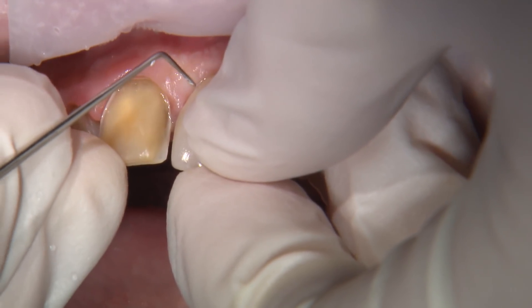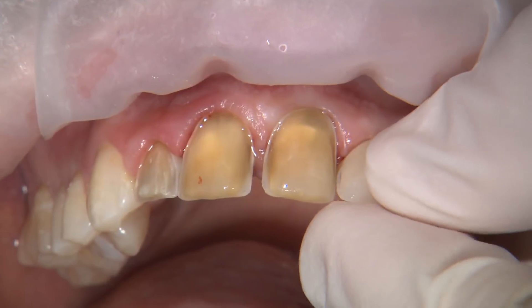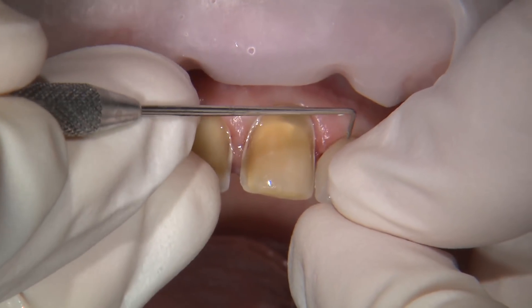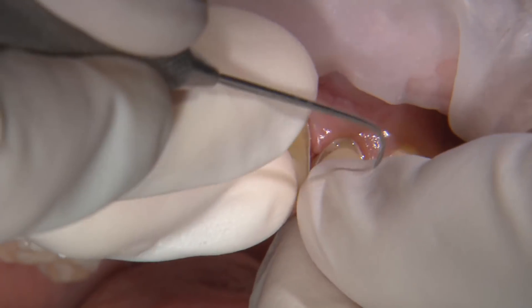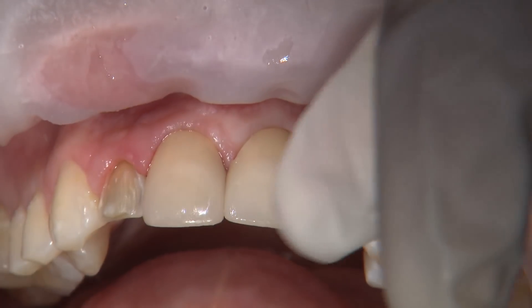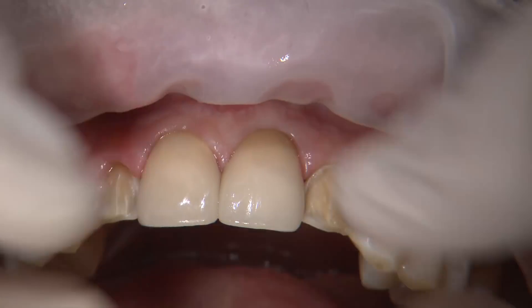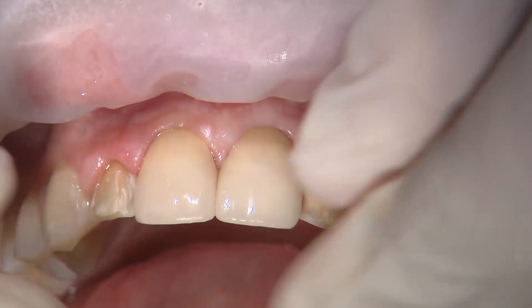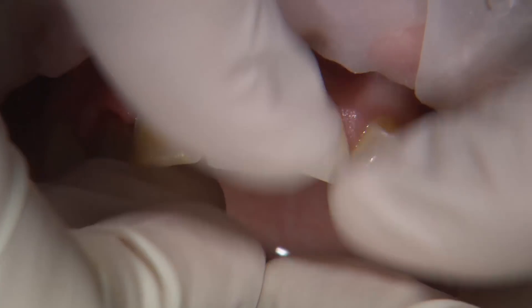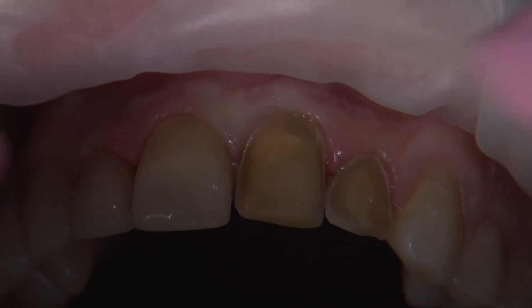I try in each veneer individually to verify they seat properly and the margins are flush to the teeth. With numbers seven and ten, I check the distal contacts first to ensure they are not interfering with seating. With multiple-unit cases, it's best to check the contacts against the adjacent non-prepared teeth first and adjust as needed. Then check the contacts of your restorations two at a time, verifying that the margins when seated together match the flushness as when checked individually. If they're off in any way, there is likely a heavy contact somewhere.